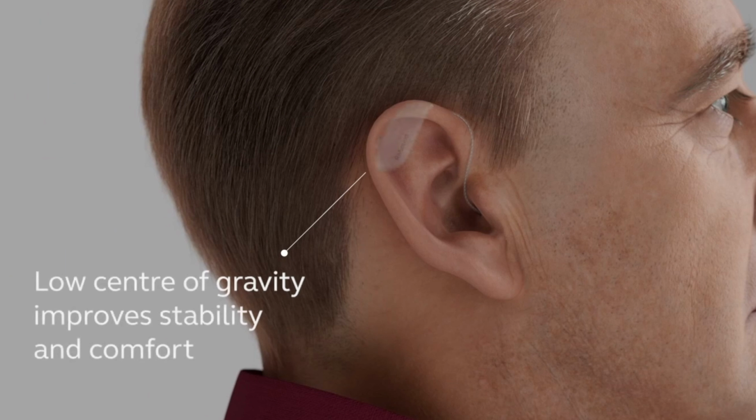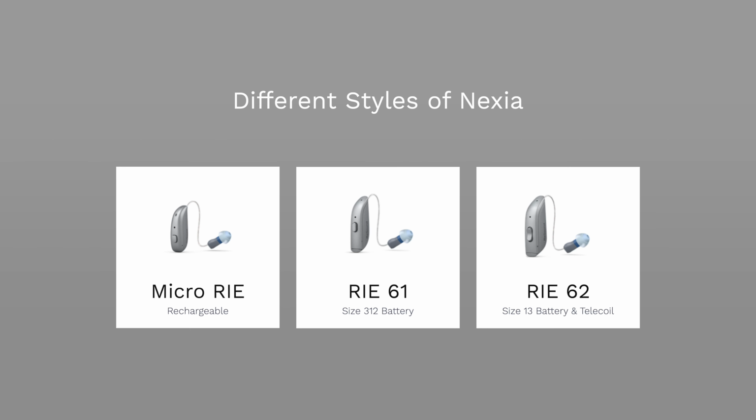Now, people might think this is a good thing because it will be less noticeable, and yes, it will be a bit less noticeable, but I don't really think that's the main benefit. To be honest with you, most open fit devices these days, you'll struggle to notice them. The main benefit is that they'll be more comfortable and will fit behind your ears better. They take up less space behind the ears, so sometimes with larger hearing aids, people might struggle if the ears are quite small or if they're wearing glasses. So the reduction in size really helps us ensure that these devices can be fitted to more people.